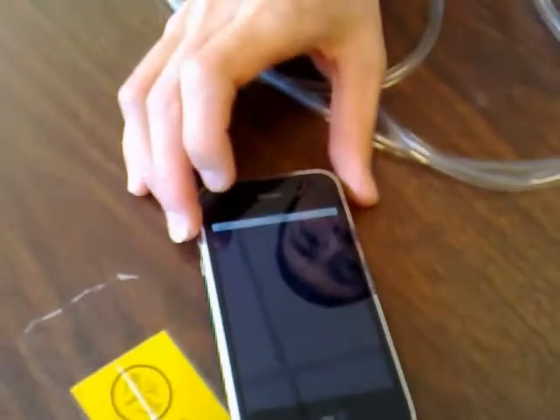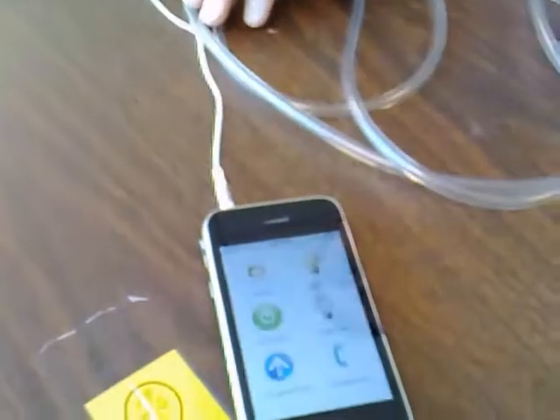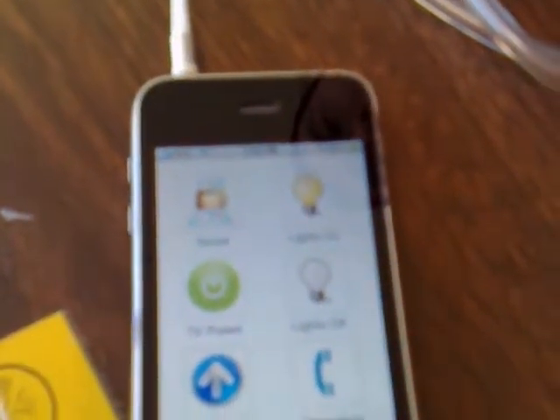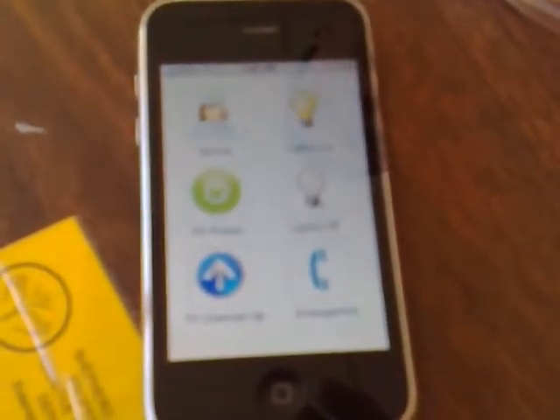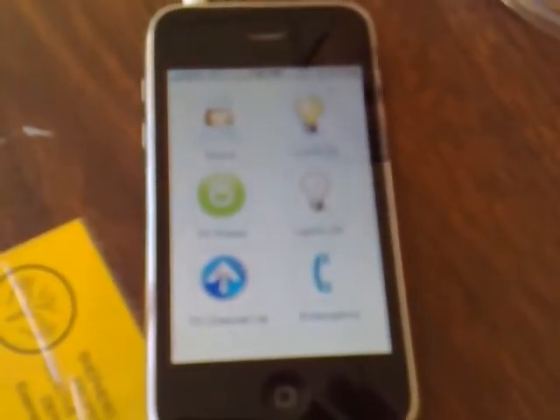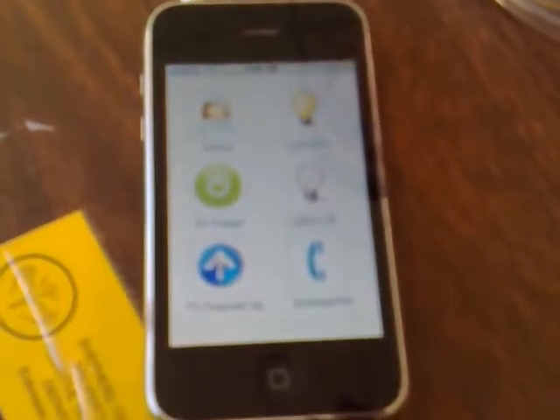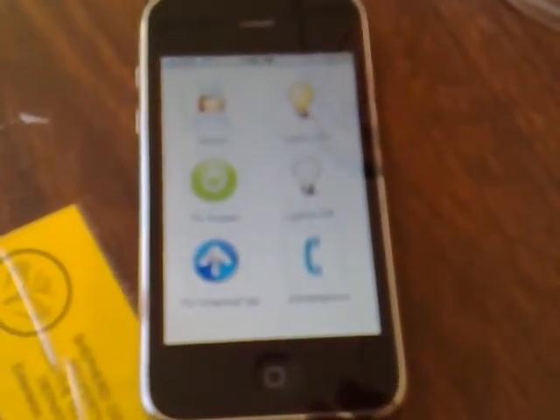As you can see here, our iPhone features our custom app which we've called Home Control for now. If I click that icon, it brings us to our interface which features nurse call, TV power, channel up, lights on, off, and an emergency call number.